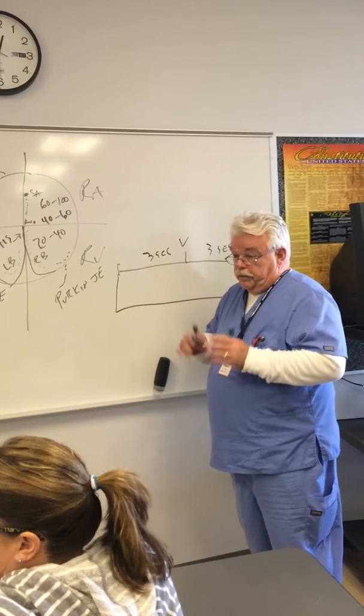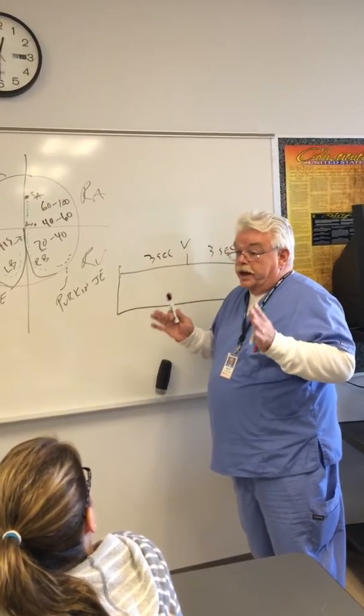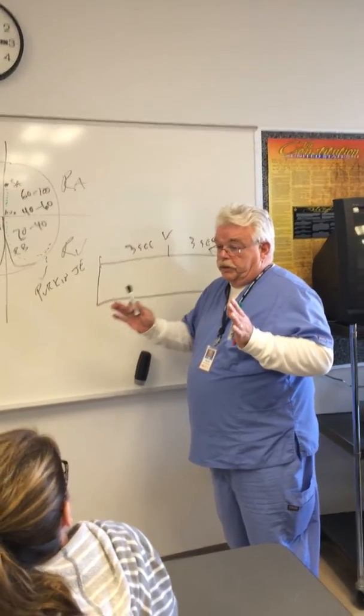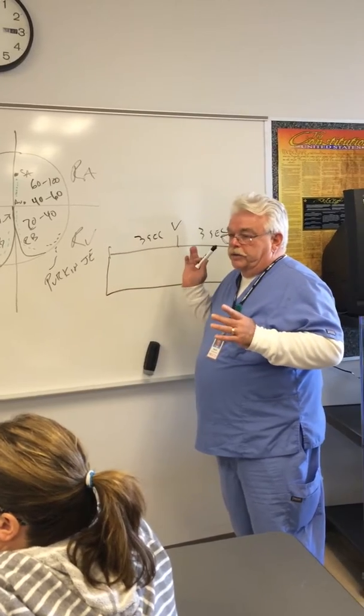You've got to do a whole minute to get an honest rate on your irregular rhythm. You have to have a whole minute. No, on your tests you're only going to have a 6-second strip. So I'm going to show you a way to do that with an irregular rhythm.